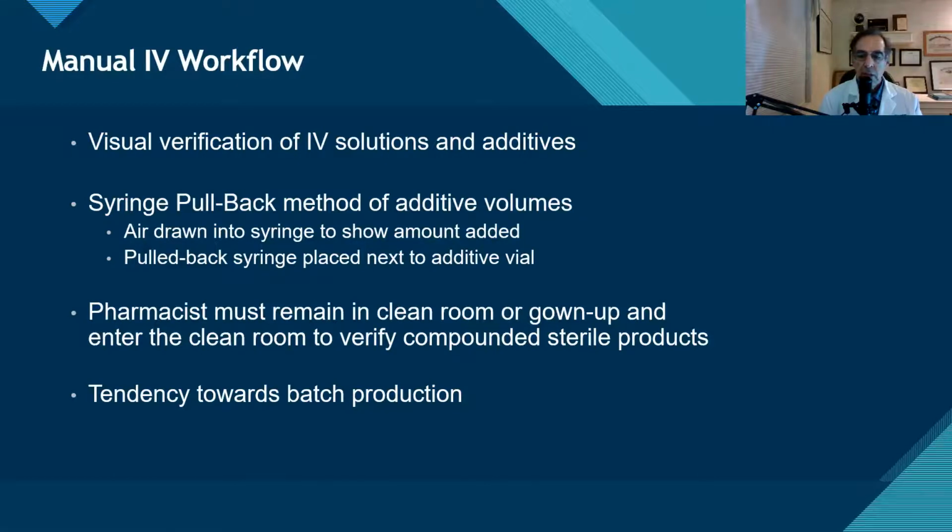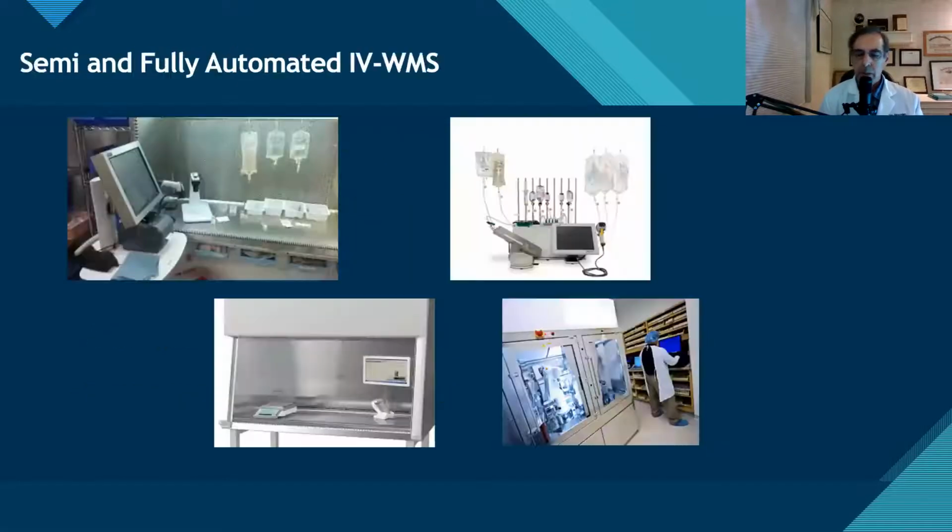And this can lead to a lot of errors with accuracy, having to stop exactly at each 2 ml increment. And then again, if there's any kind of distraction, you might end up causing a medication error with too much or too little in a given bag.